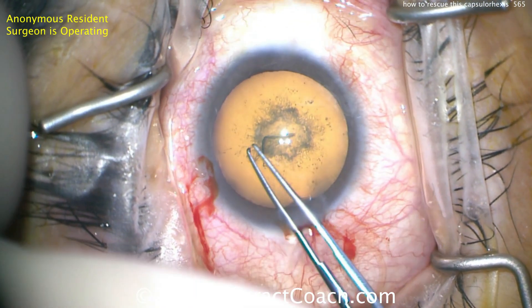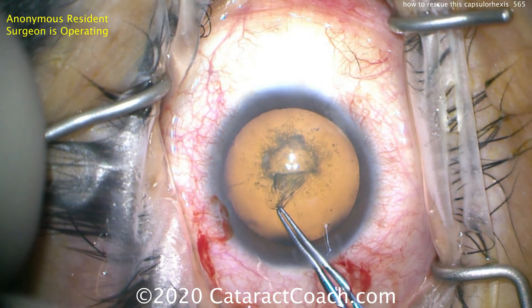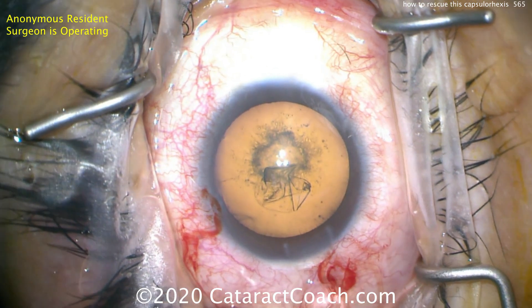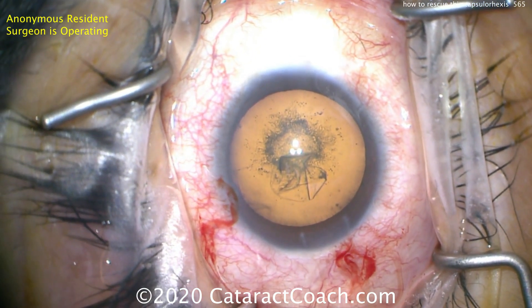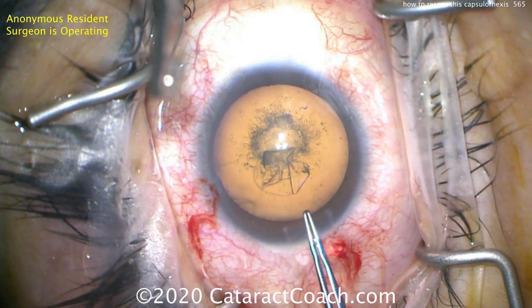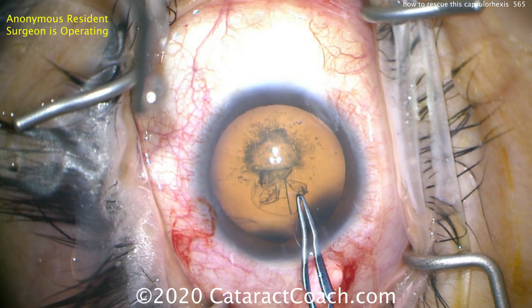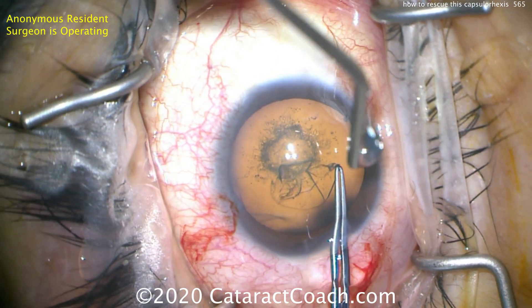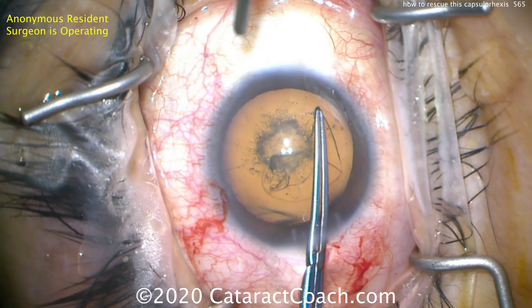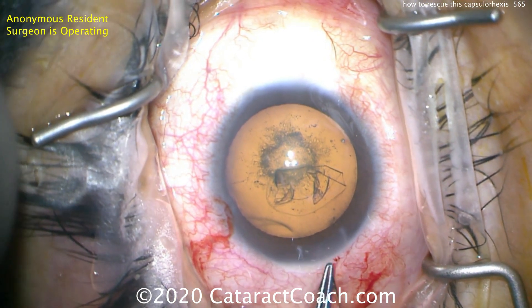Now switching over to the capsulorrhexis forceps. Starting with the forceps, a good grab of the lens capsule here, and starting to bring it around — that's a really good size right about there. Now readjusting a little bit. Watch what happens: the start is off. Grabbing the capsule here, and as the rhexis continues, the side of the incision is being hit by the forceps.